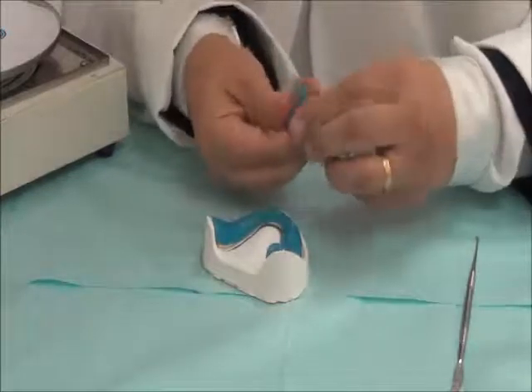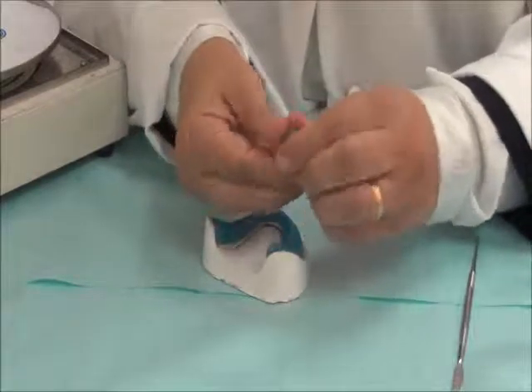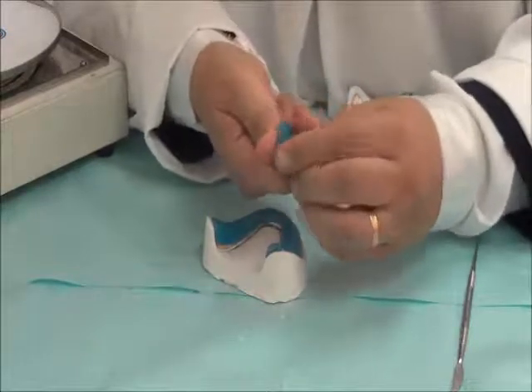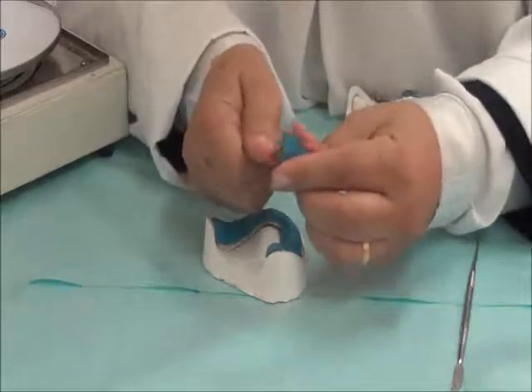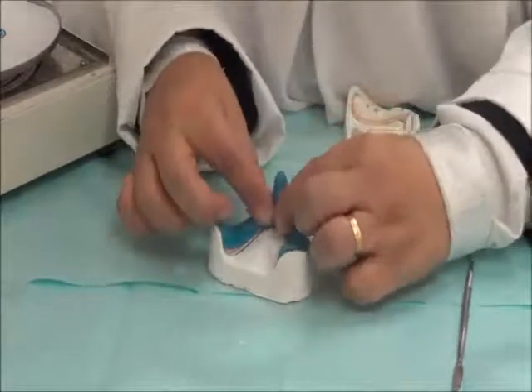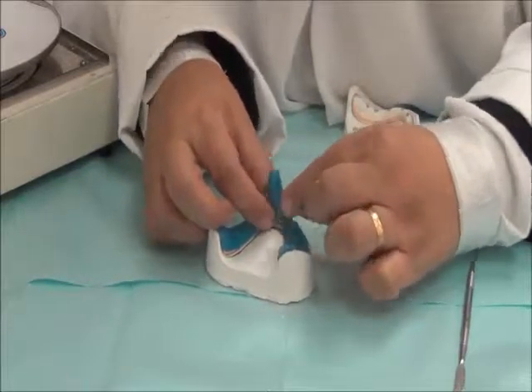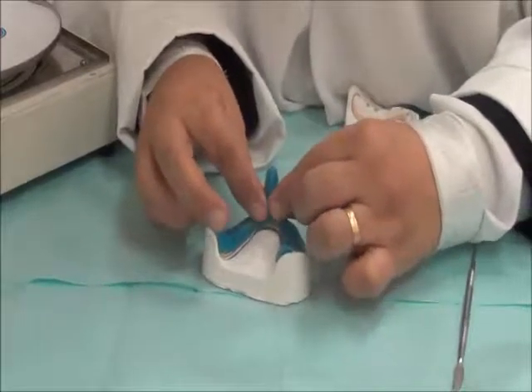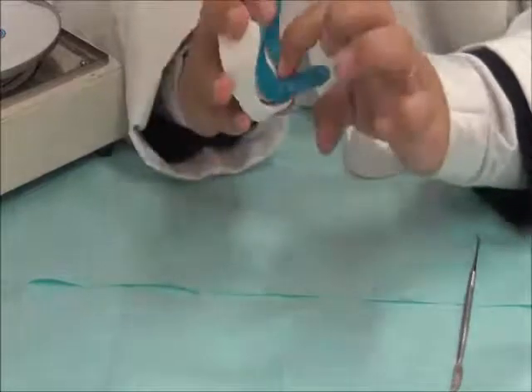So we formulate the handle. Once more, we form it in a roll shape first. Then we press our thumb and begin rotating it against our thumb. This will widen at the base area and thin the outer area. In the base, we place a groove, and this groove can adapt to the cast. In the case of the lower, the tray itself is thin in the interior margin area. So we need to make sure that the handle is not bulky over this area. Once more, we adapt it well to the tray.